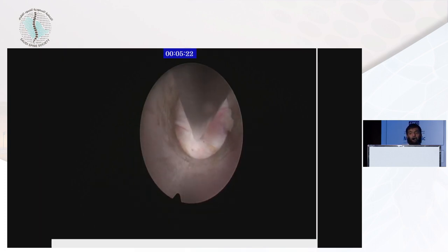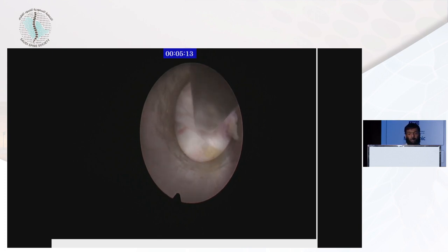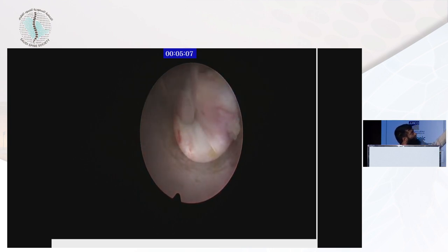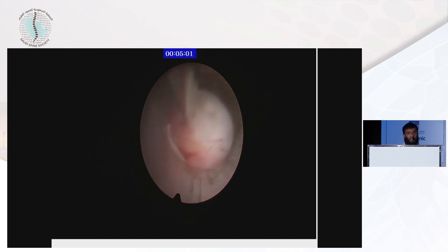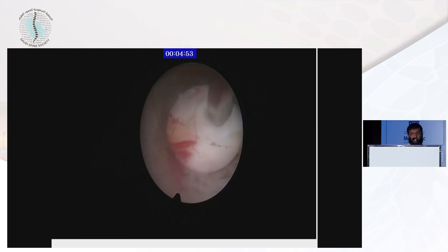Then, directly after going through the ligamentum flavum, we identify the nerve. Here I can show you — when I retract the nerve, the nerve at 12 o'clock is the medial side. So I retract it medially and rotate the sleeve to find the annular tear. Here is the annular tear, and the part of the herniated disc is visible as I can see.